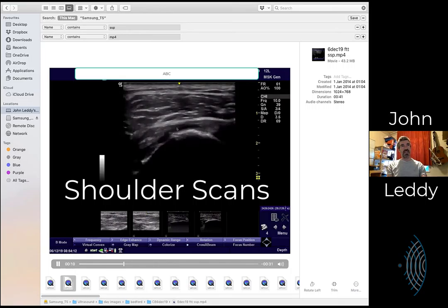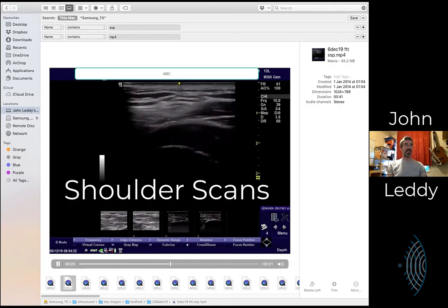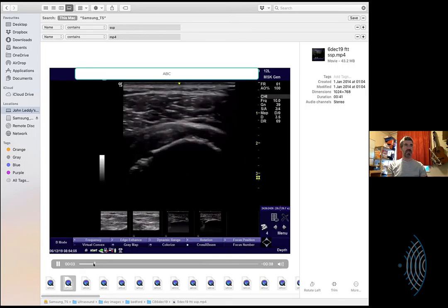So, full thickness tear. I'm just going to flick through some of these. You will have seen briefly before, so I won't hang about with them. And some of them are actually not very good. But this is supraspinatus here, coming up. This is the greater tuberosity. And this is a tear here. I'm not showing it terribly well, but you can see the cartilage. You can see the edge of the tear there quite nicely.